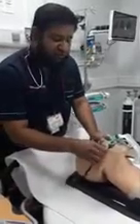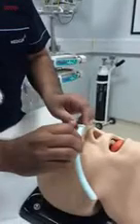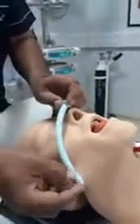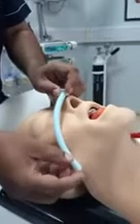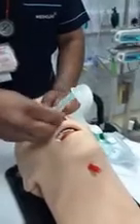The second option we have is the nasopharyngeal airway. This is the nasopharyngeal airway. First lubricate it. How to measure it? The measure is tip to tip, the tip of the nose to the tip of the earlobe. Then you have to insert it with a rotating movement. The rotating movement will ease it through the patient's nasal airway.